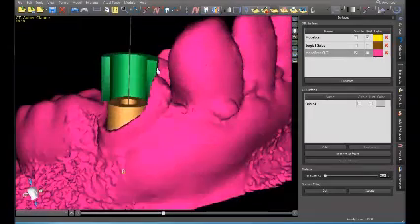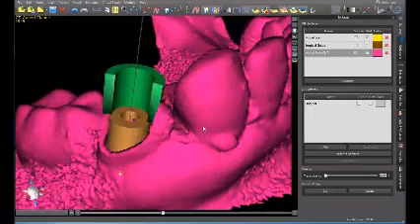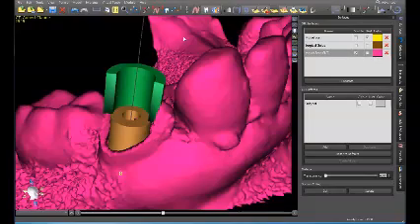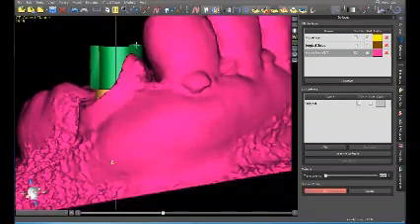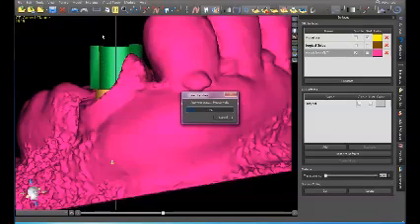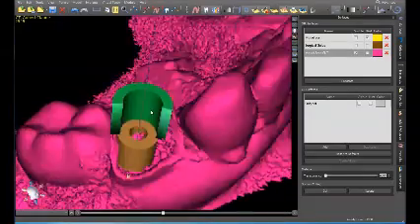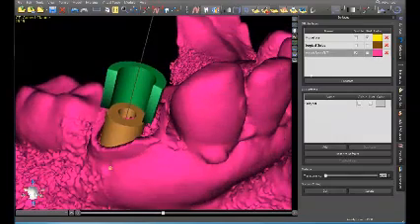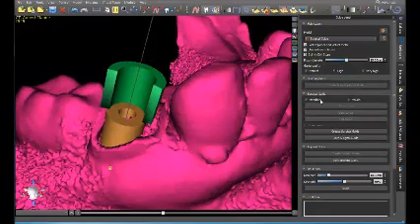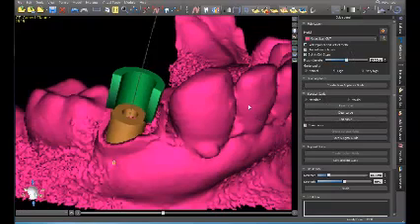And then we can clip this little piece right here. You just got to be careful when you're cutting. If I would cut like this, I'd be cutting this background too, because it's in 3D. So that looks something like this. That's not too shabby. And now when we go back into guide panel, this time to click on the pink one, we'll click edit curve, and it won't come off. So now we got to redraw it.